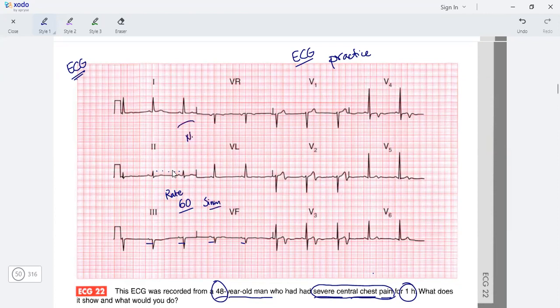Axis is normal. Looking at leads 2, 3, AVF - normal. 1 AVL also normal.